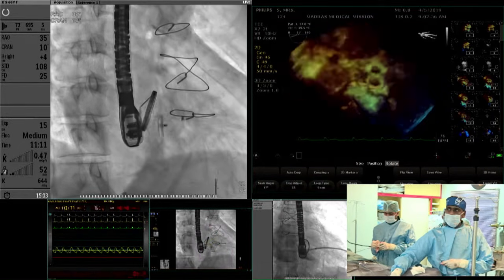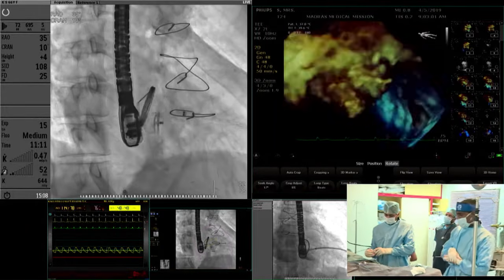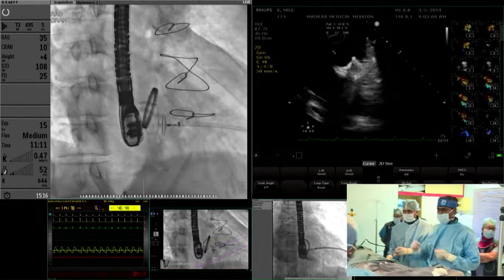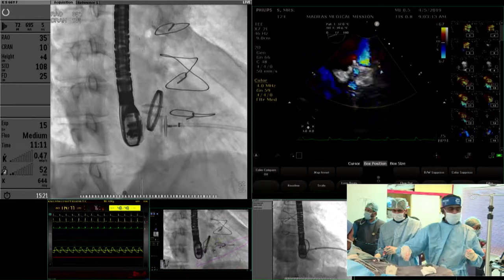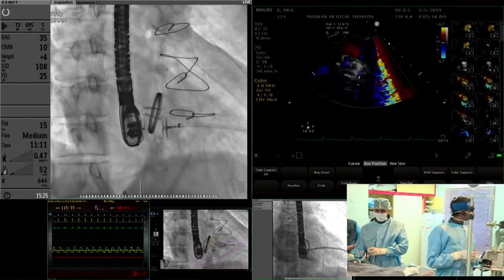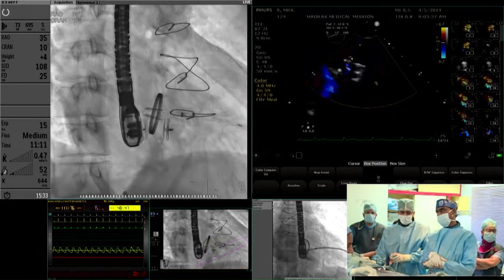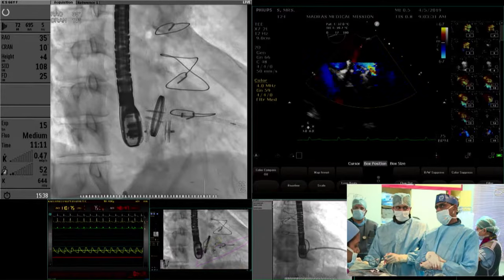What is the largest sheath size that you can close percutaneously? We have done it for up to 9 French. We have used an 8/6 PDA device in those patients. Of course, surgically we have gone larger. This is not the same as the previous Amplatzer vascular plug. Take a 6 plug. Up to 12 has been used percutaneously. Dr. Wilkins said up to 12 French sheaths have been closed percutaneously in this center.